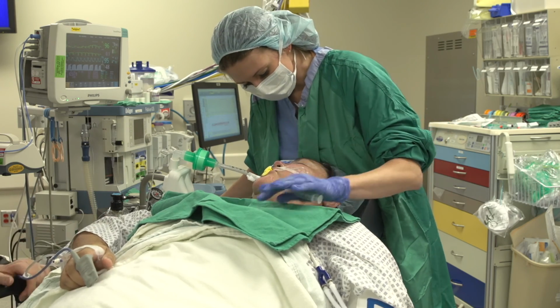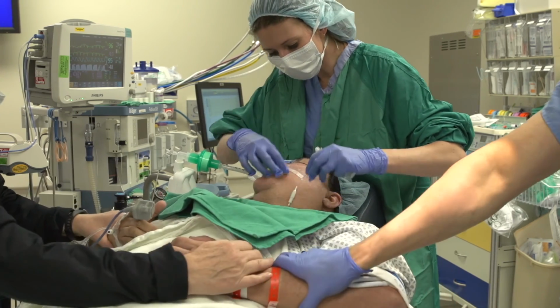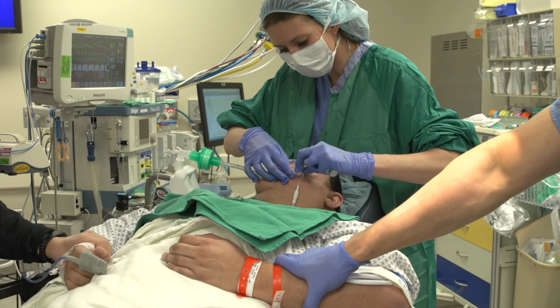If adequate hyperventilation is applied and the patient is not encountering the effects of too much opioid or muscle relaxant, emergence can occur at any moment. Be ready, as emergence can occur up to 50% faster. Some patients will possibly not exhibit the common signs associated with emergence, such as prolonged coughing or stage 2.